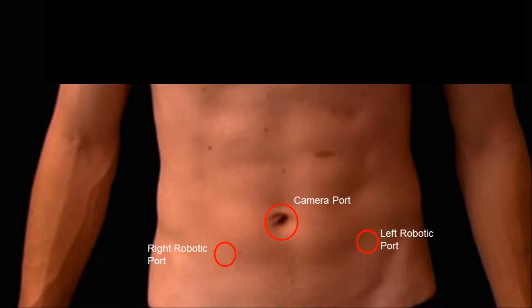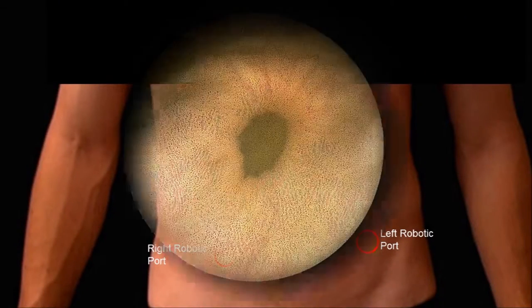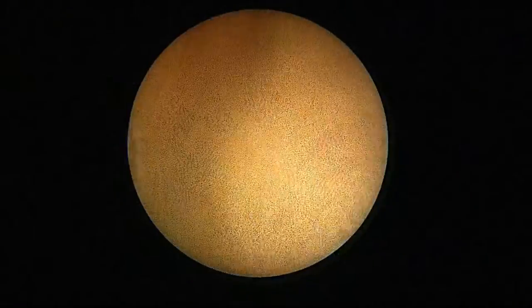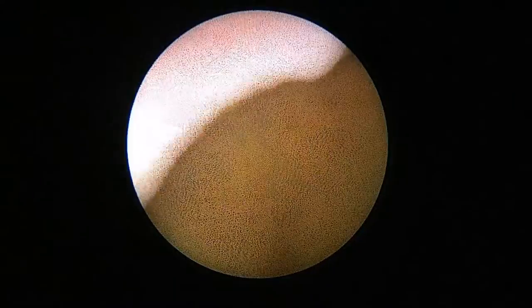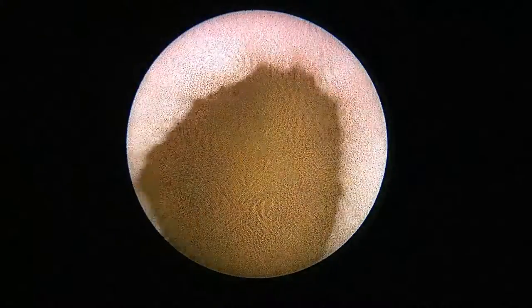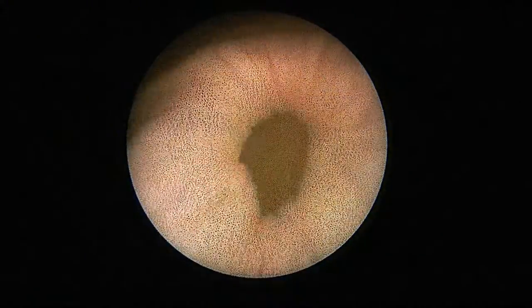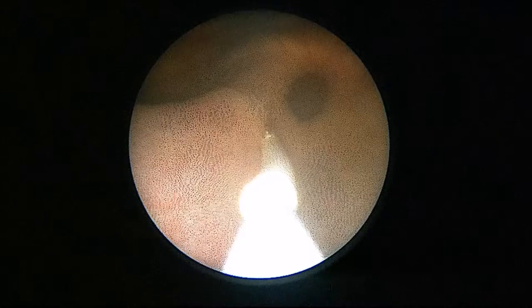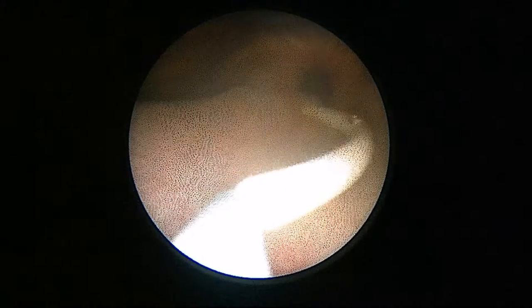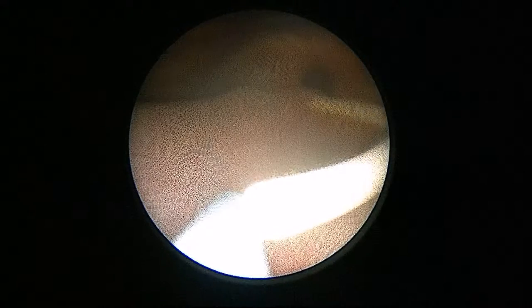This is a schematic of a robotic trocar placement. We began with cystoscopic examination of the diverticulum and its proximity to the left ureter. An indwelling ureteral stent was left prior to robotic dissection.